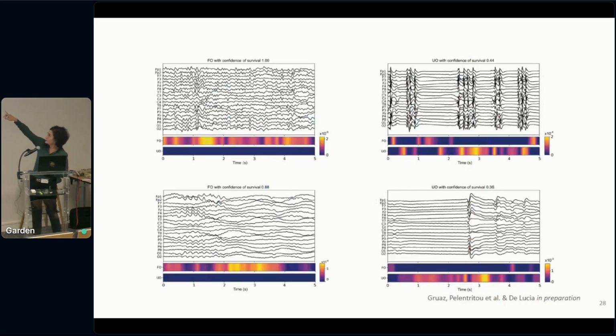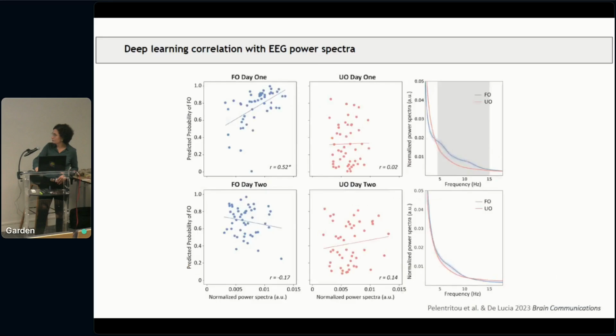So here, for example, in the second panel, you see that the weight for unfavorable outcome in the second bar is concentrated along the epileptiform discharges that are known to be what are called malignant patterns and normally indicative of a bad prognosis. For favorable outcome patients, this weight is more widespread because it resembles more a normal EEG. And one could go and see across all the different recordings what can be informative.